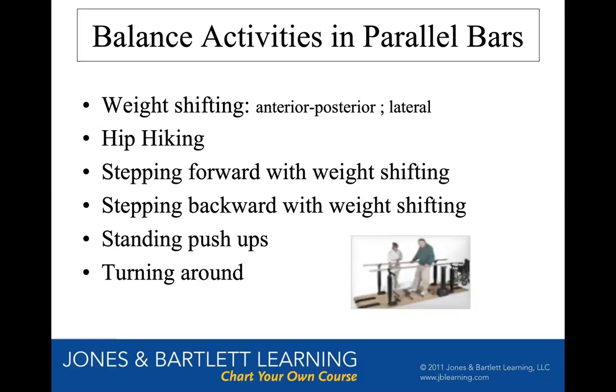And you wouldn't think about this, but parallel bars are usually only about 10 feet long. So once you walk to one end of them, you got to turn around. And that's a whole different ball game right there, because then the person's got to let go with one hand, rotate their trunk, hold on with both hands to the same bar, then start doing weight shift and moving their feet.